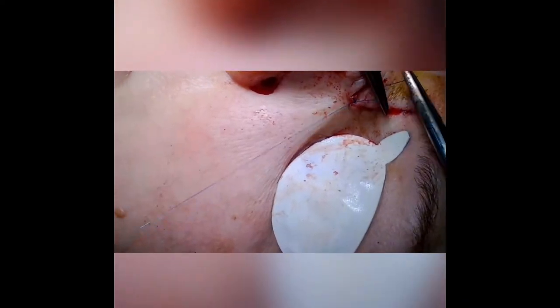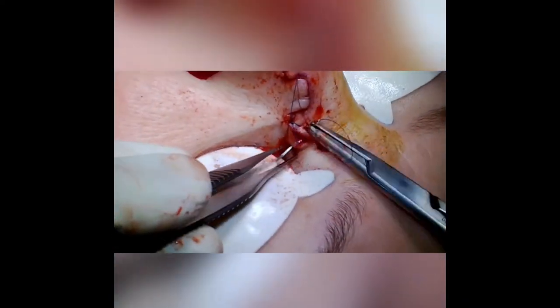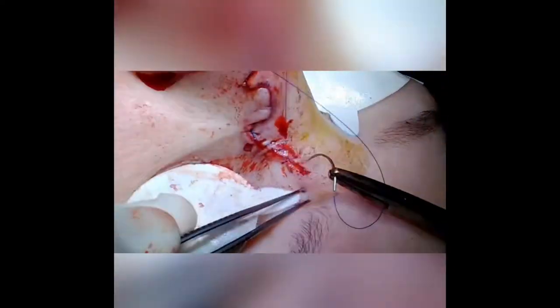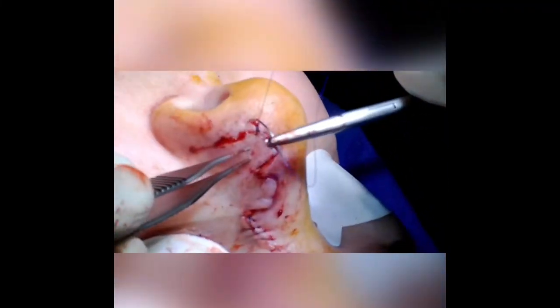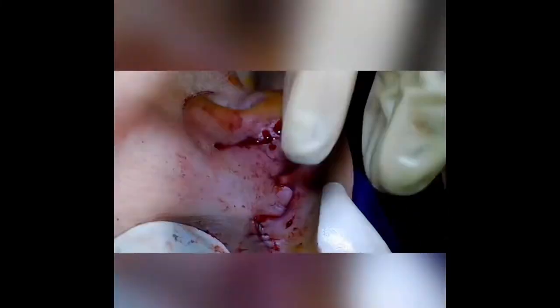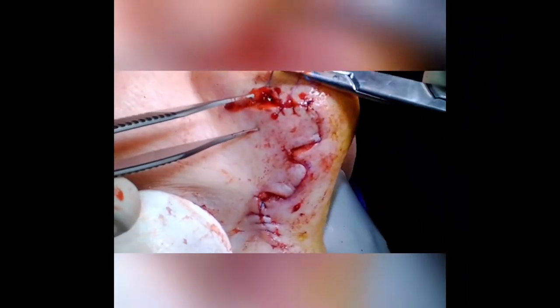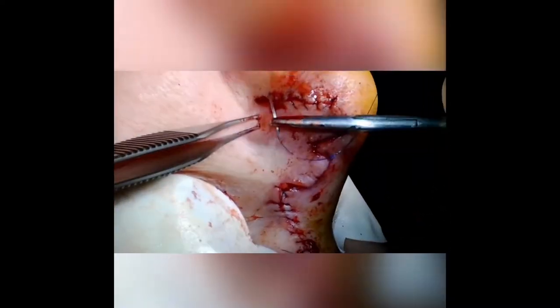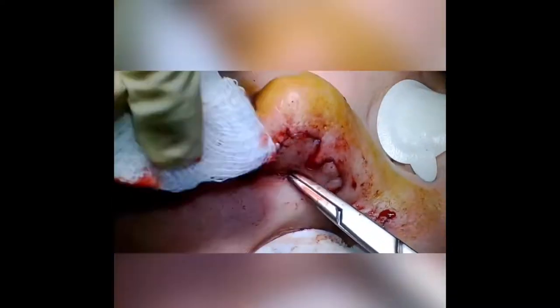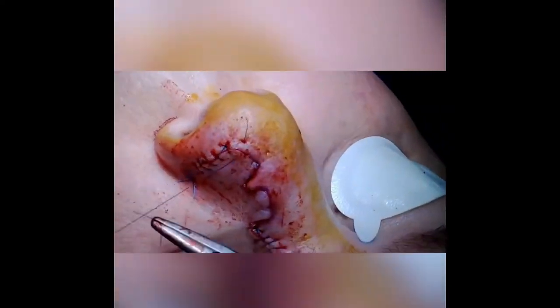Using a 5-0 Prolene on a PS2 needle, I close the donor site from the second lobe with a simple running suture. All of the tension has been alleviated by the movement of the flap and the deep dermal sutures — this layer is just about getting the skin edges to evert for proper healing. I'll also do a running suture across the straight edge at the bottom of the first lobe and the closure of the standing cutaneous deformity, then interrupted sutures to evert the edges of the first and second lobes.